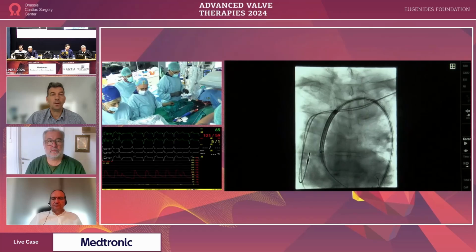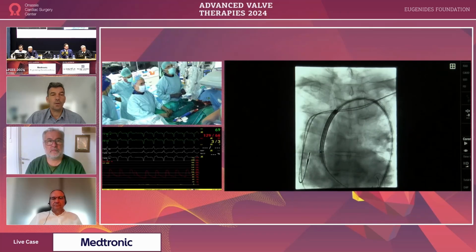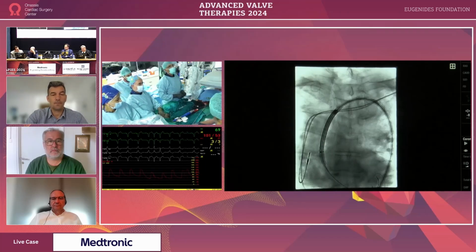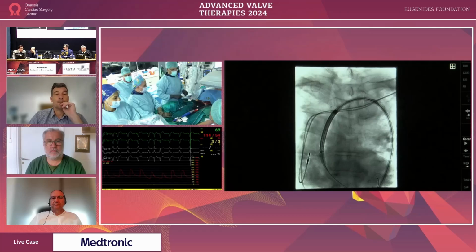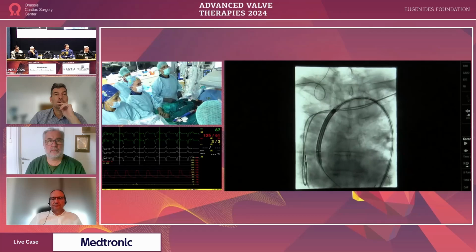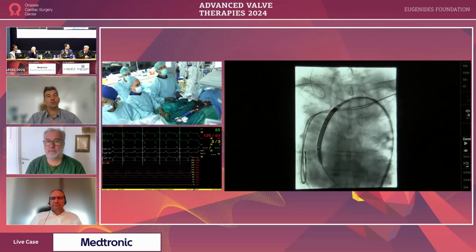So at this point, we have recaptured the valve 2 times. Would you change the valve and, or would you consider this the last time? Off-label. How many have they done? 3? They did 3 or 4? I don't care. Actually, sometimes much more.